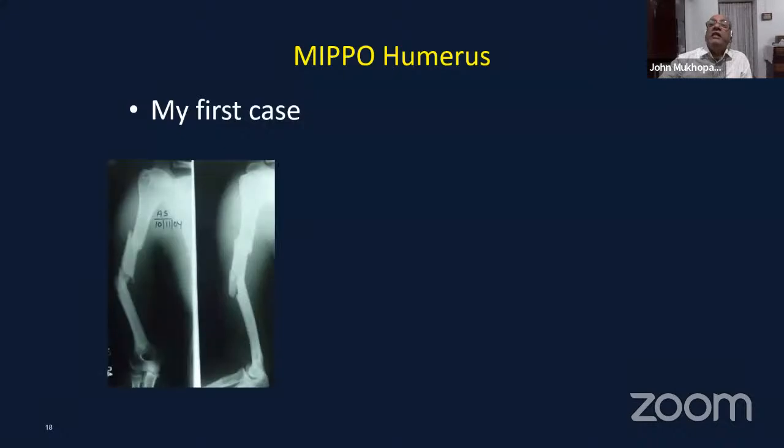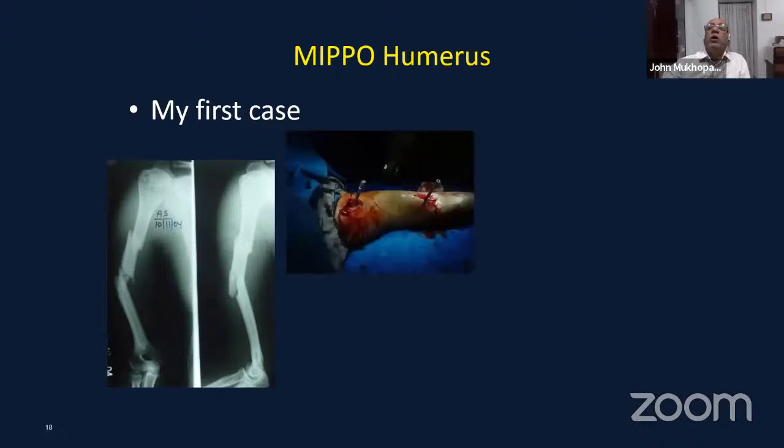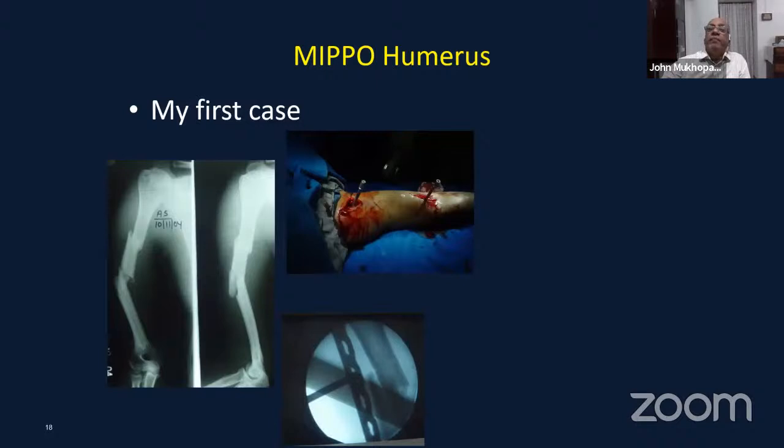Incidentally, the first case we did was way back in 2004. This was a patient with a segmental fracture and a very narrow medullary canal. If the canal was wider, we may have nailed. Because the canal was very narrow, we decided to do a MIPPO technique here.